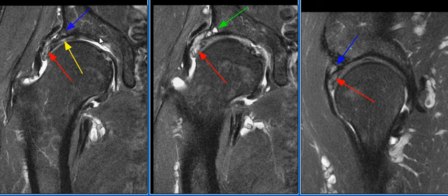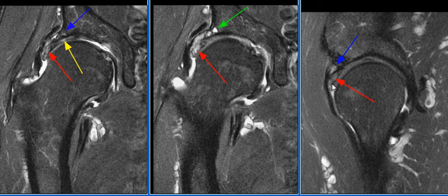The acetabulum is mildly dysplastic. The anterolateral labrum is hypertrophied and degenerated with a longitudinal tear. There is spurring of the acetabular rim laterally with subchondral cystic change.